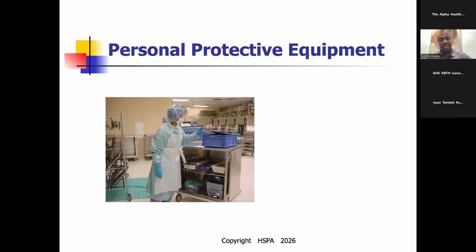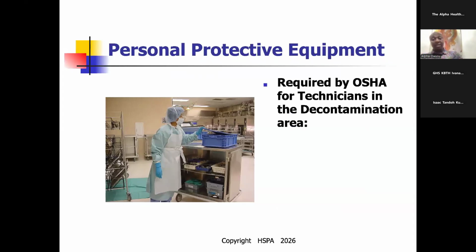And please, my team, my wonderful cadres, this is how you have to dress. Very, very important. These are the supplies, the consumables that we have to make sure we wear to save our staff and also patients. That is OSHA. This is how you have to dress in your decontamination area.